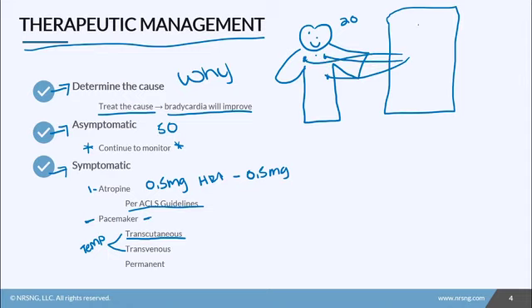And I'm going to turn on the defibrillator to the pace mode. I will usually set it at a heart rate of about 60 to 80 beats per minute. So it's going to send electrical activity transcutaneously to the heart so that the heart will start automatically pacing at whatever rate I set it for.